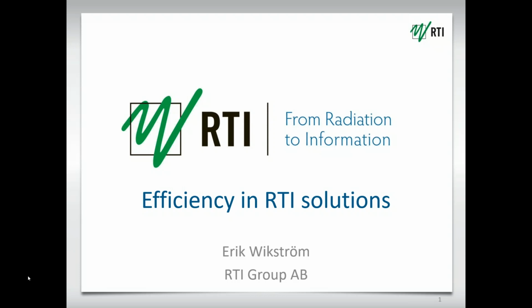Well, good afternoon, everybody, and welcome to this presentation, which will highlight some areas of potential improvement when it comes to the efficiency in the diagnostic imaging QA process. I'd like to thank Linda and her colleagues for the help in preparing this event, and it's great to see that so many of you have joined us.